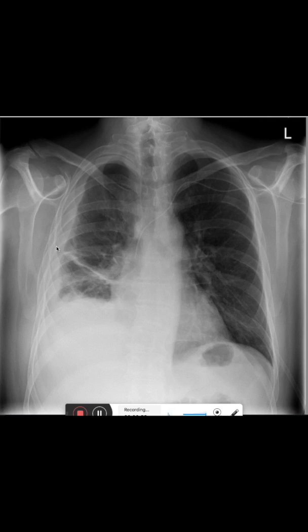We also see that the patient has a foreign body inserted here, through the left subclavian vein, and then it goes down to the vena cava superior. This is most likely a central venous access that is used to deliver medication.